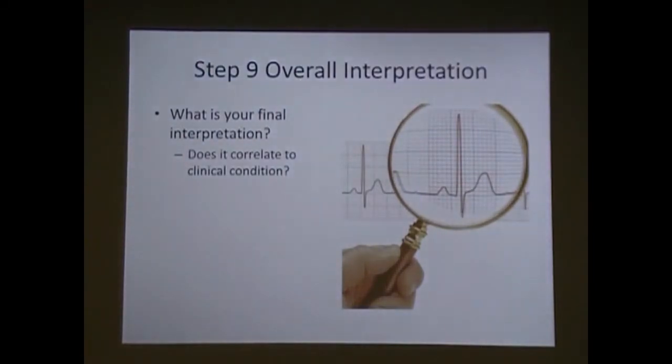I just had an upset stomach. Boom, I'm doing an EKG on it. I don't care because it's only paper. But if I'm missing this, I could not be doing the right thing for the patient. So it doesn't hurt to waste paper.